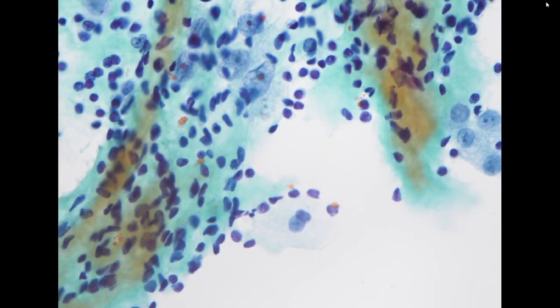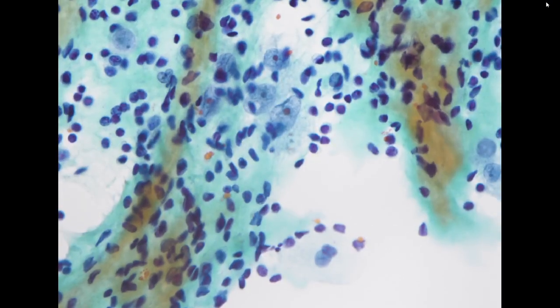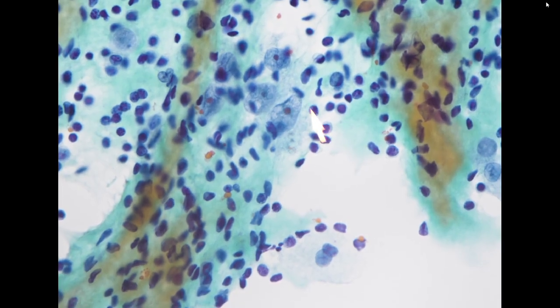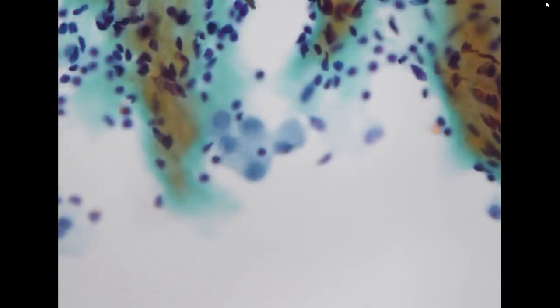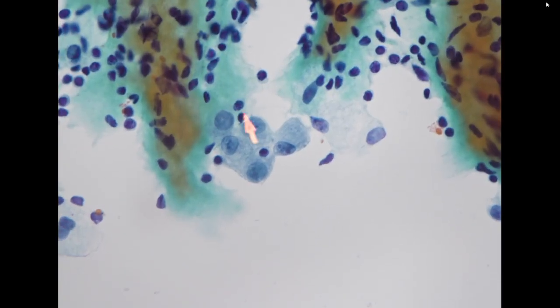So here we definitely see very atypical cells. There's a very large nucleus with very prominent nucleoli, almost as big as a lymphocyte. And the cytoplasm is bubbly, foamy, so it is compatible with adenocarcinoma, and it is hiding inside this proteinaceous material.